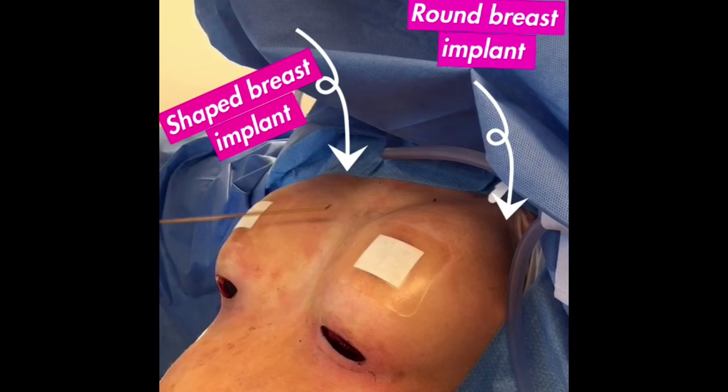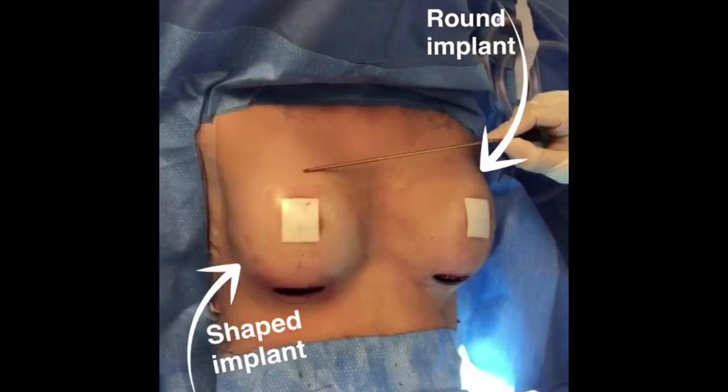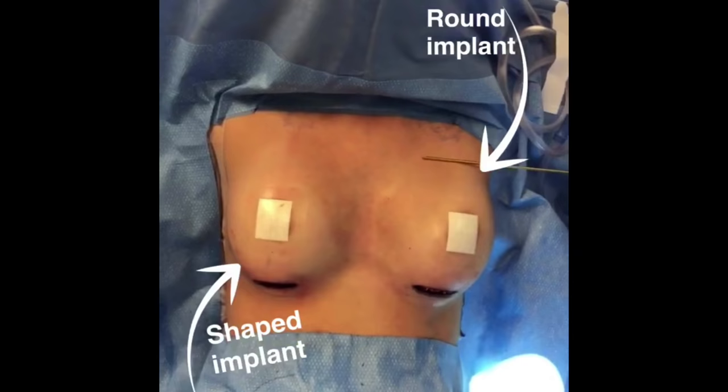What you can see here is we have a teardrop shaped implant on this side and our round sizer on this side. Look at how much more natural the top of this breast is, whereas the round has a very obvious difference between the round and the shape.